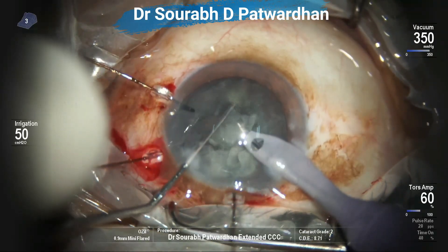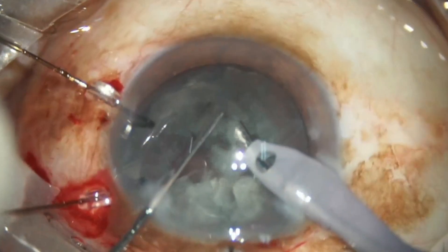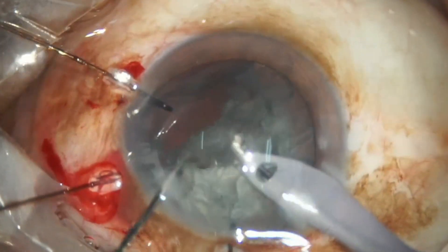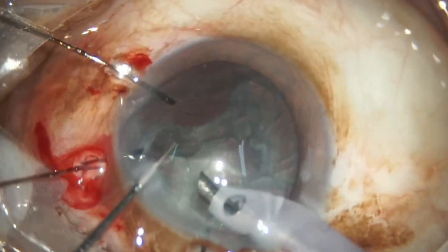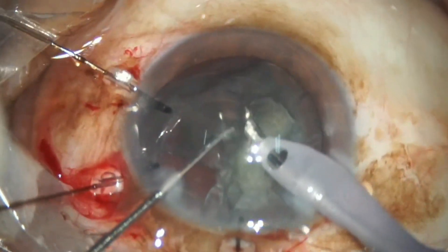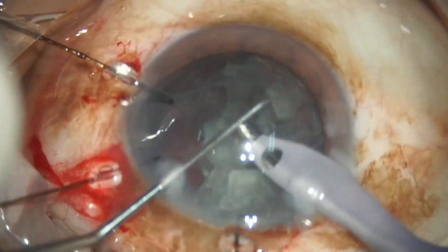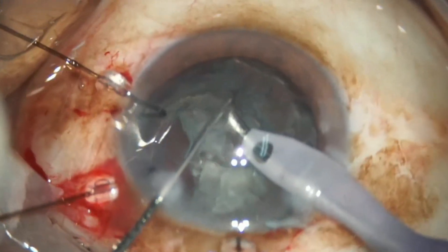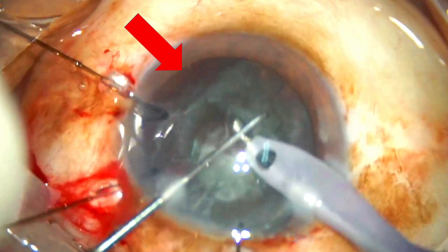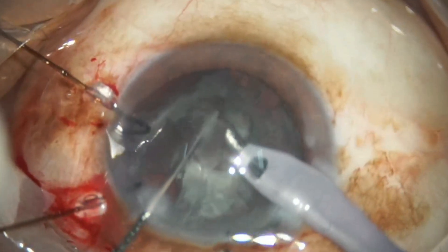You have to keep watching the bag and its behavior. You have to keep vacuum just enough to emulsify and aspirate the nuclear pieces. Though I have put capsular hooks at three places, you can see on the inferior part that the capsular bag is trying to come into center and can get aspirated by the faco probe anytime. So once you notice that, irrespective of how many capsular hooks you have inserted earlier, you should insert one more to support this part of the bag.